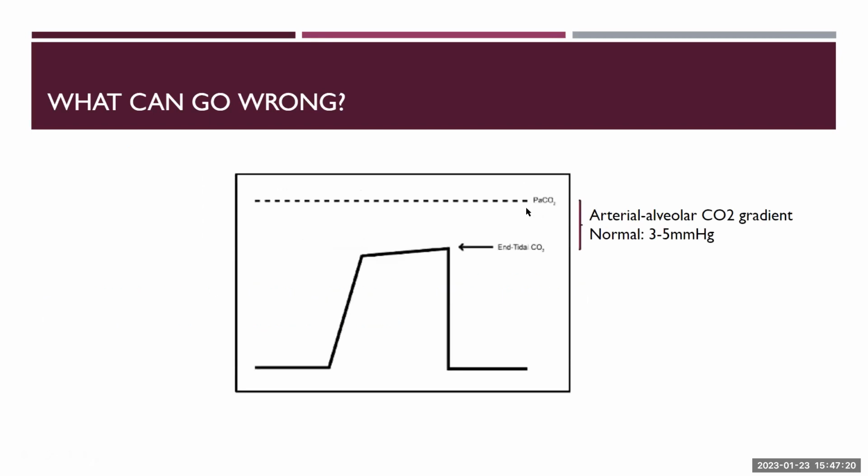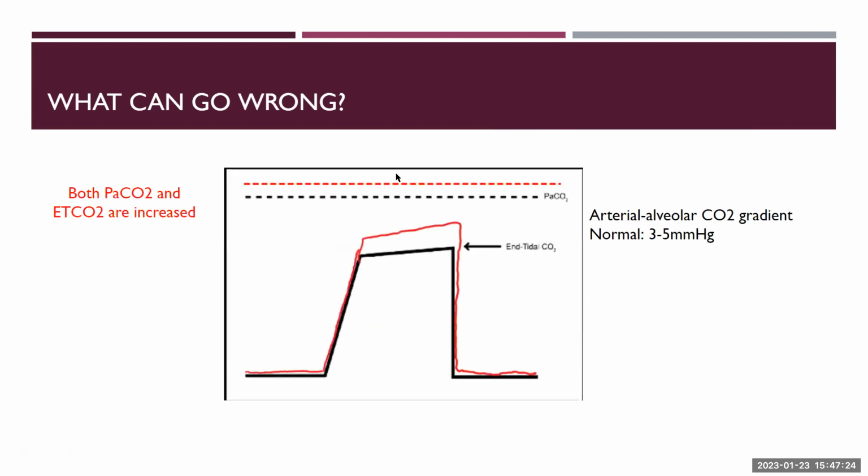So this is our PaCO2 and our end tidal. So if both of them are increased, does anyone know what that could kind of mean? Anyone? You can be wrong, it's allowed. It helps us know where we have to go.